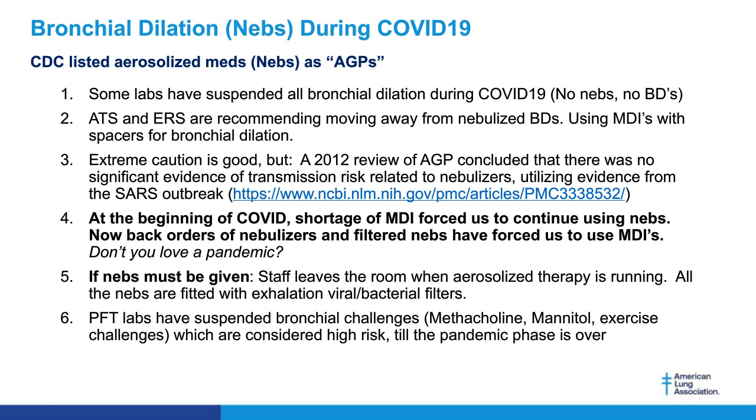Extreme caution is good, but I think the CDC was acting with extreme caution because there really is no data that suggests doing an albuterol neb or any neb treatment, with the patient just breathing normally, causes any aerosolization of a virus. Anyway, a 2012 review of aerosol generating procedures concluded that there was no significant evidence of transmission risk related to nebulizers. This was from the SARS outbreak. SARS is a similar coronavirus, and you can read the study here if you like, although we never know exactly, as each virus is slightly different.